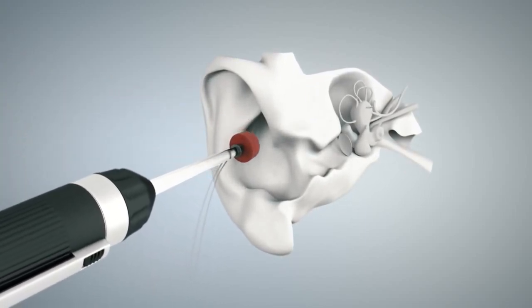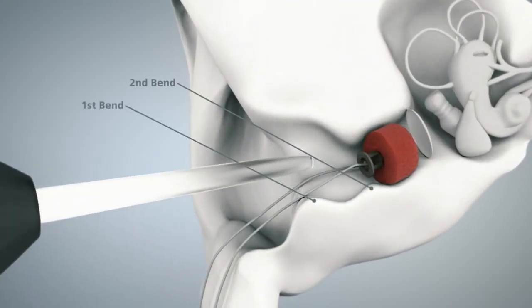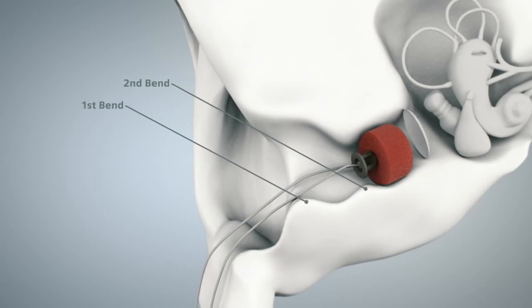Position the impression dome after the second bend, just as you would for any other CIC impression. Make sure the dome seals the ear canal and that the bullet is centered.